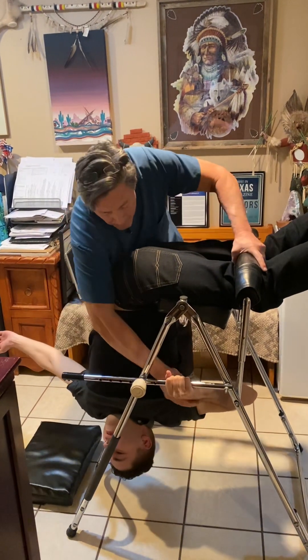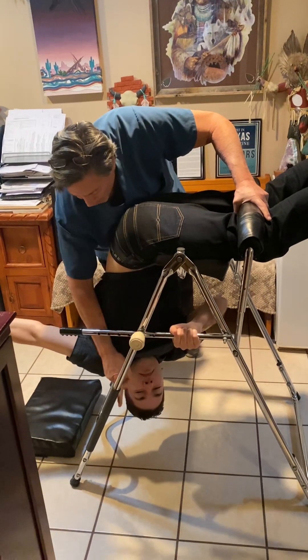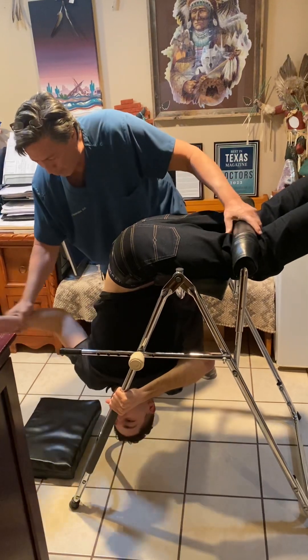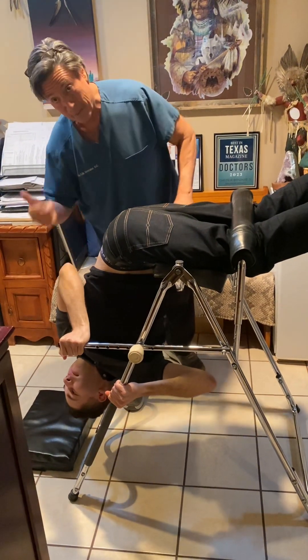Now this hand — you can grab over there, Eric. You can grab up top. You can grab over here. You need to experiment and see which feels better. You can also grab right here and use that to push and torque. Some people like to do that.